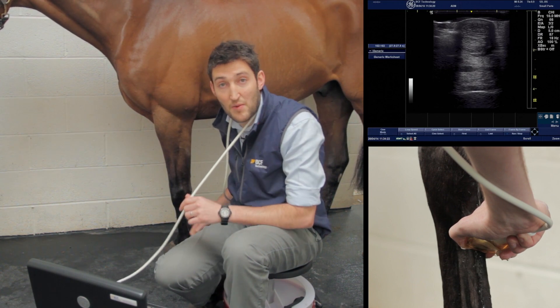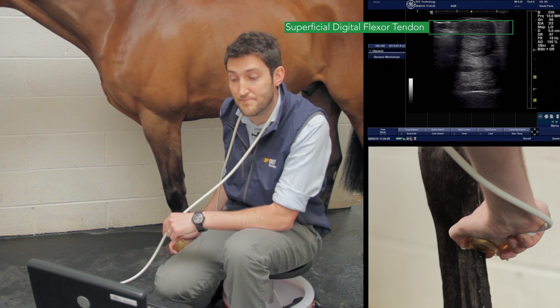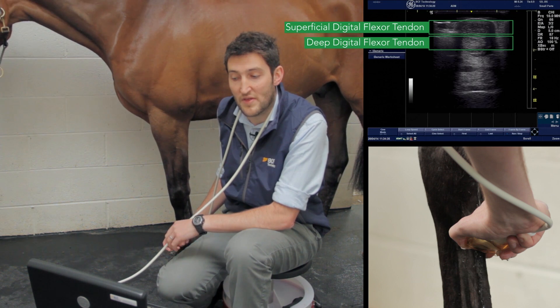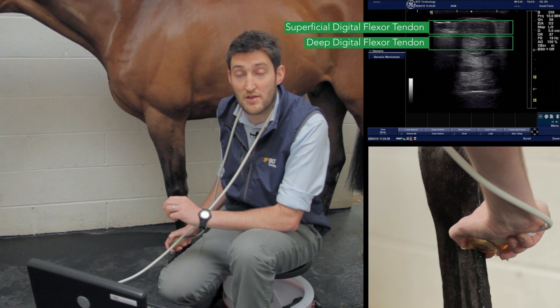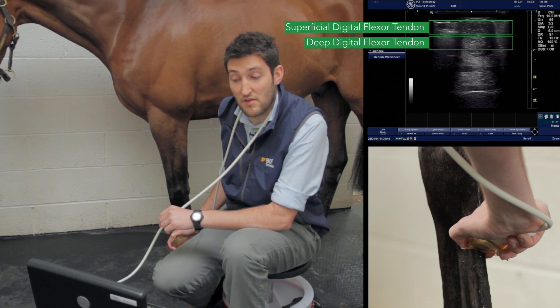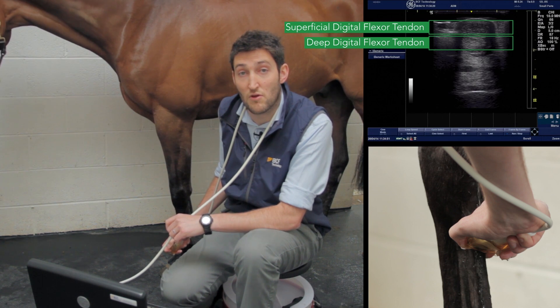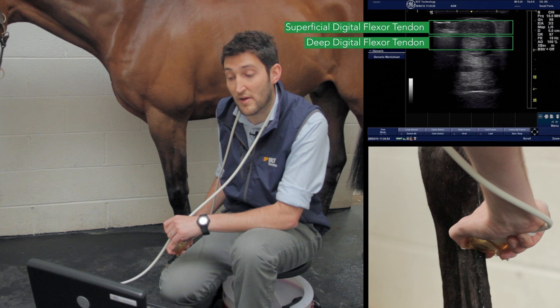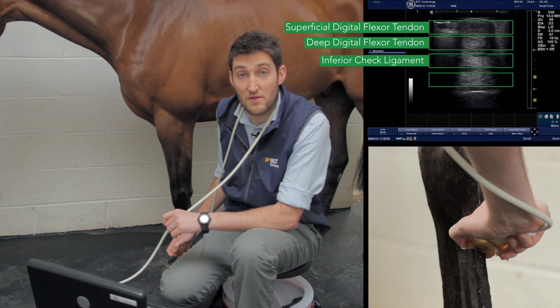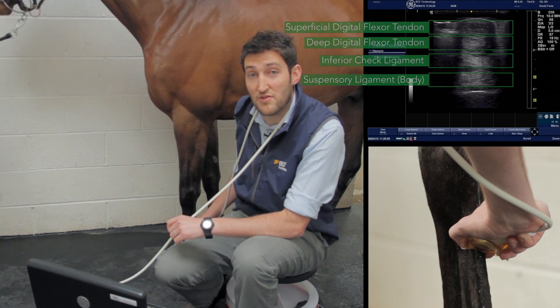At the top of the screen we have the skin and superficial digital flexor tendon, below that the deep digital flexor tendon — much the same as higher up the leg, except the superficial flexor tendon is starting to thin out. Below the deep digital flexor tendon we can still see remnants of the carpal sheath, which is getting thinner as we come distally but remains visible in zones 2a and 2b. Below that is the inferior check ligament, and then the suspensory ligament — both still rectangular but starting to flatten and widen, so their edges are missing.